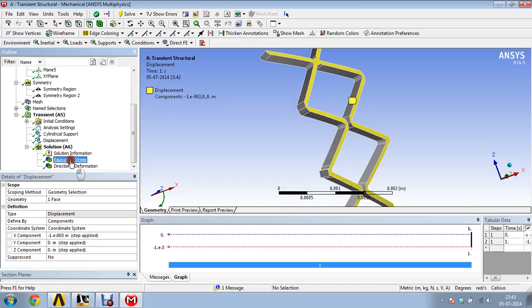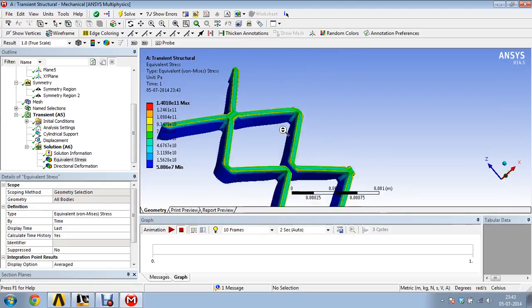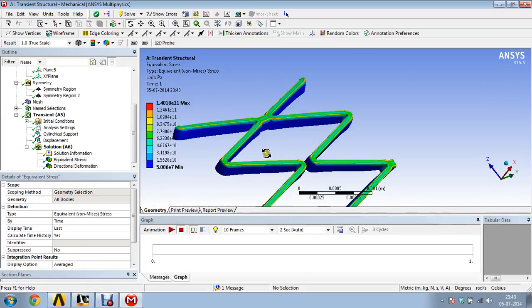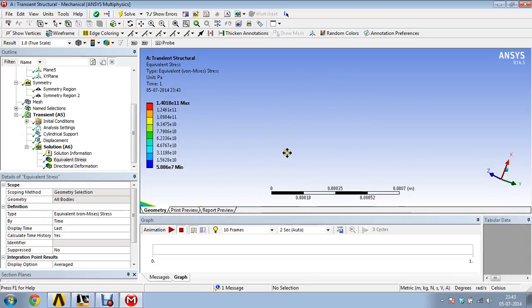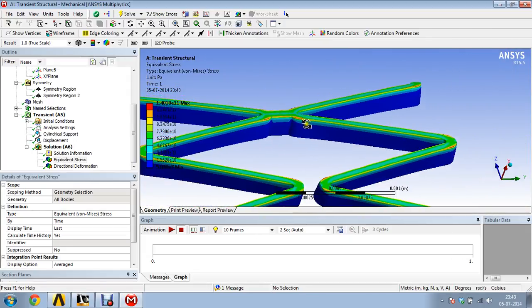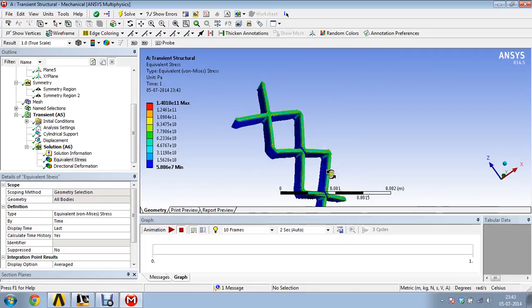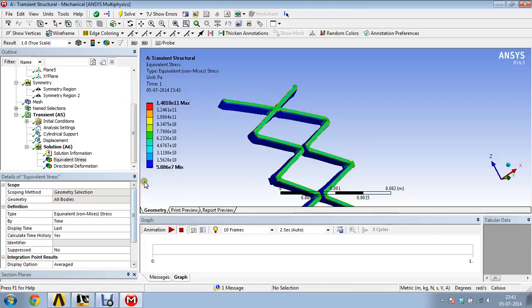The solution is already there. So there's the equivalent stress. You can see the equivalent stress, and most of it is on the outer surface. You can see it very clearly. The stresses which you can observe from the full body are around this value, which is bearable, and we can manage with this stress. There is no problem with this stress.